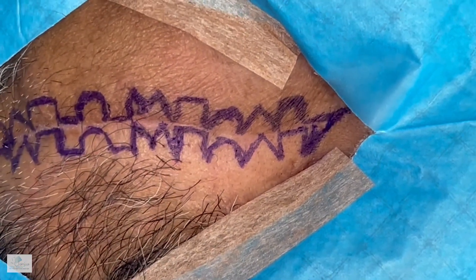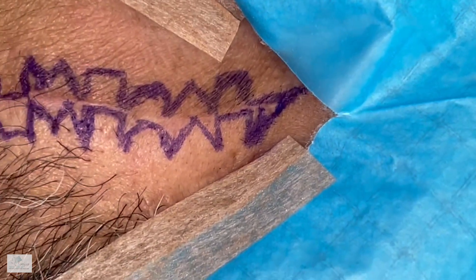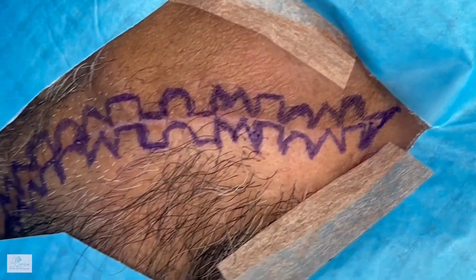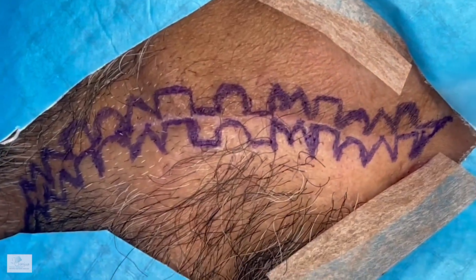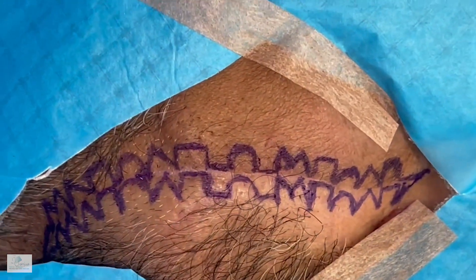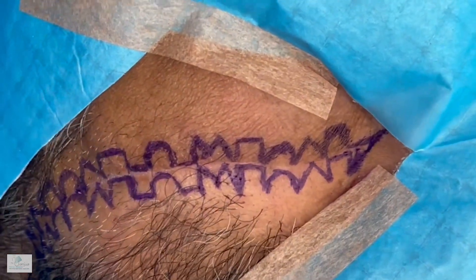The marking is complete. As you can see, starting there we have a variety of different shapes including triangles, squares, rectangles, M's, circles, and half circles as well. The width has been five to six millimeters, which is usually perfect to get a nice camouflage.